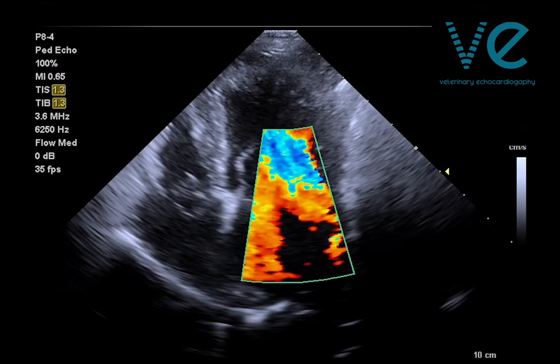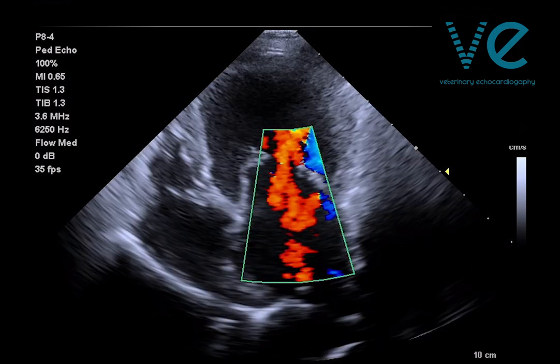If you were to send this dog for mitral valve repair and perform an echocardiogram the next day, or even a few days later, you would visually see that this left ventricle is impaired. The severe mitral regurgitation is masking the underlying systolic dysfunction. There are all sorts of fancy ways to demonstrate this, such as strain and tissue Doppler imaging, but the main takeaway here is that in patients with severe valvular regurgitation, we should always be extra cautious when assessing systolic function, and we certainly shouldn't look to something as flawed as fractional shortening to give us an answer.